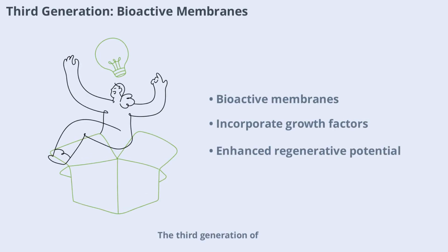The third generation of barrier membranes incorporates bioactive components such as growth factors to further enhance tissue regeneration. These advanced membranes not only provide a physical barrier, but also actively stimulate cellular events that promote healing. EPTFE, one of the most inert materials, is often used due to its chemical stability and biocompatibility. The addition of growth factors represents a significant leap forward in regenerative dentistry, offering improved outcomes for complex cases.